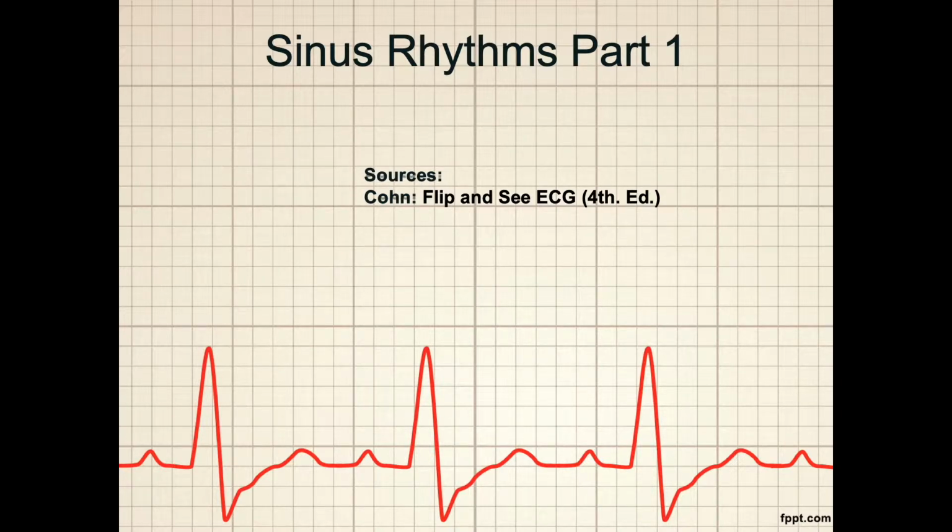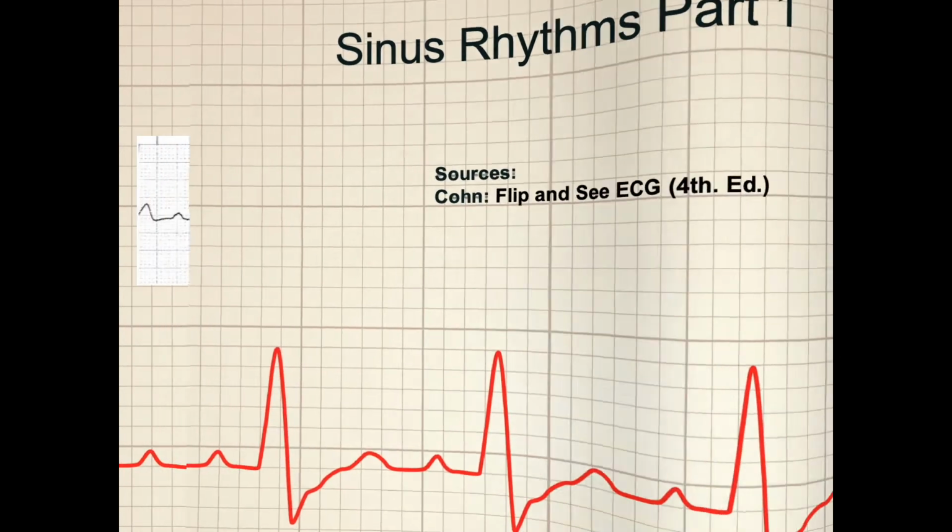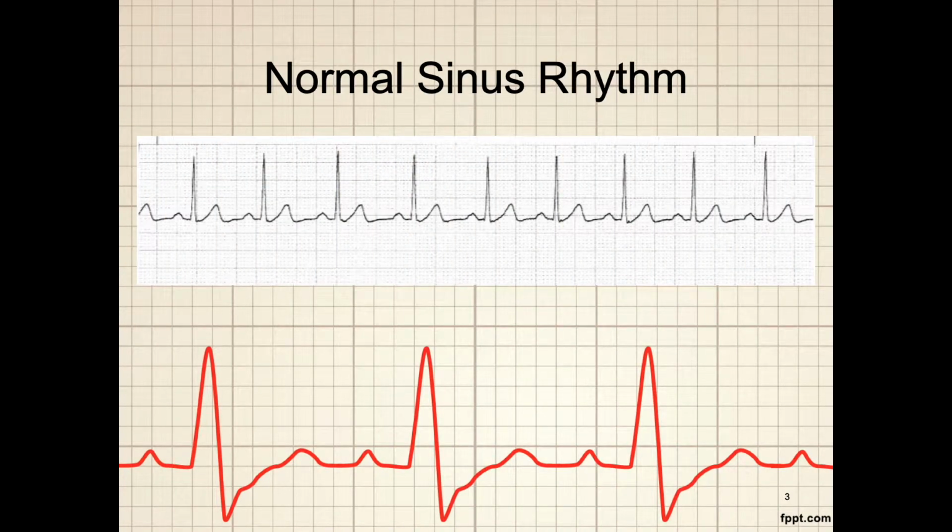Research has revealed that the impulses that go through the heart go, for the most part, in a specific and recordable pattern. That pattern is known as normal sinus rhythm. And here you have an example of normal sinus rhythm. Notice that both the atrial and ventricular rhythms are essentially regular. There can be a slight variation in the rhythm, and that would be considered normal.